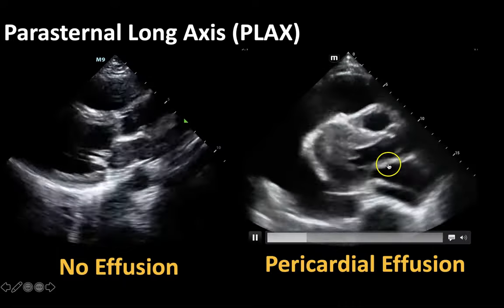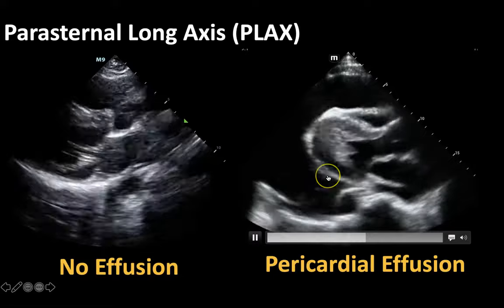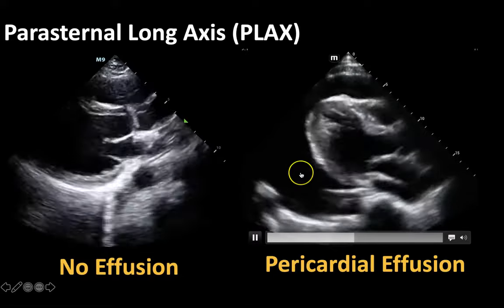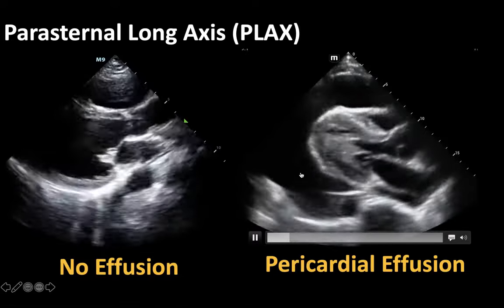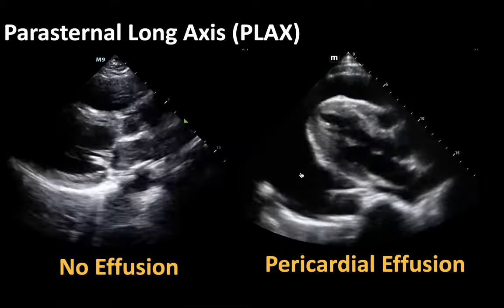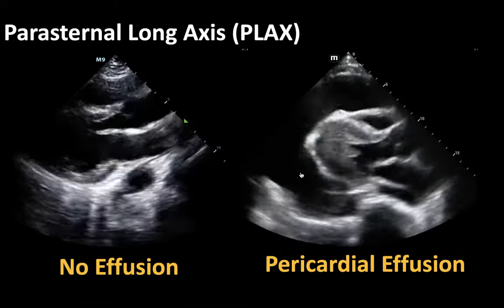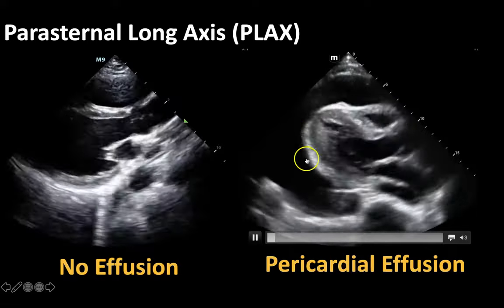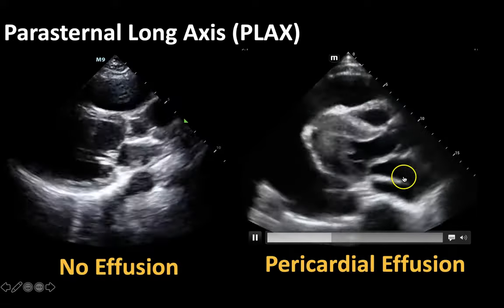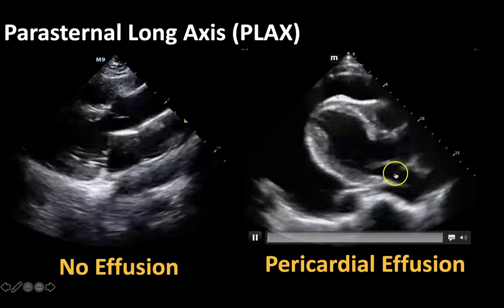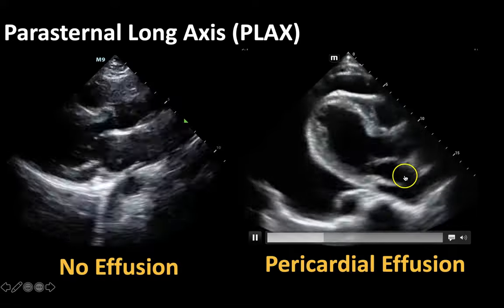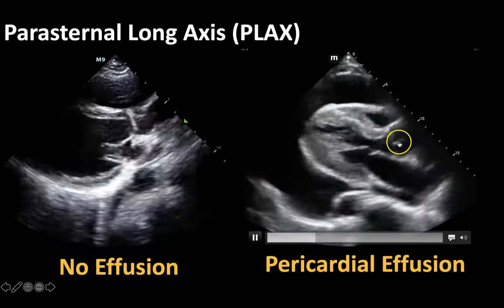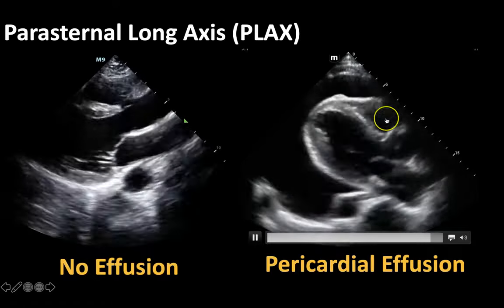Then we look at this heart on the right side of the screen, which looks very different from the one on the left. This is actually also a parasternal long axis view — it just looks a bit different because there's a large pericardial effusion around this heart. To orient you, we do still have here's your left atrium, your left ventricle, your aortic outflow tract, and your right ventricle.